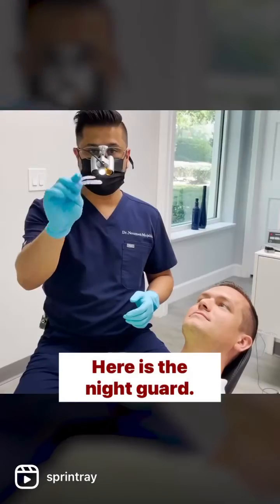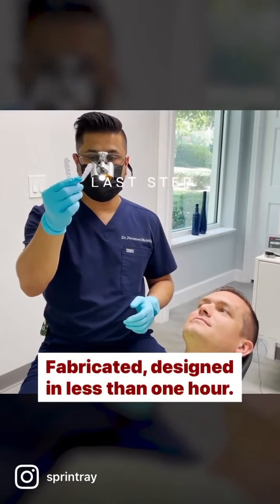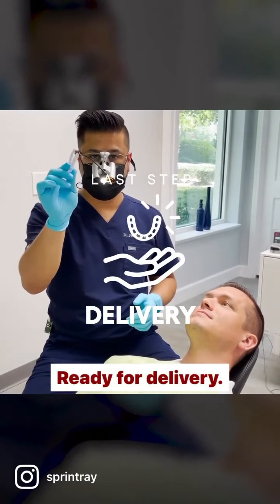Here is the night guard, fabricated and designed in less than one hour, ready for delivery.